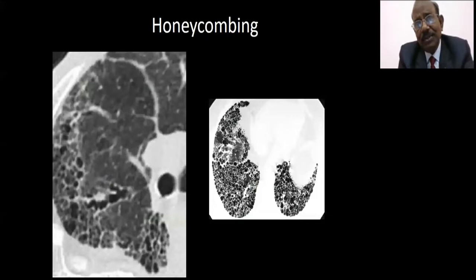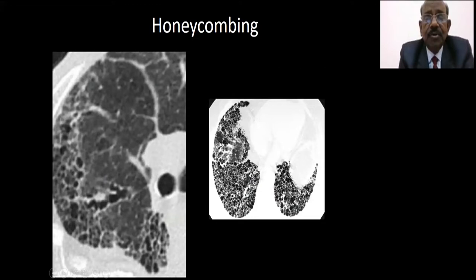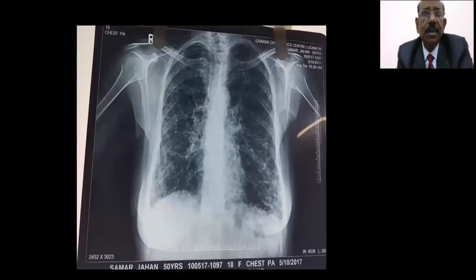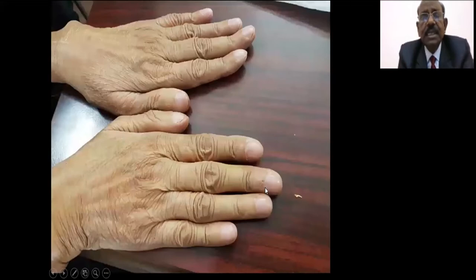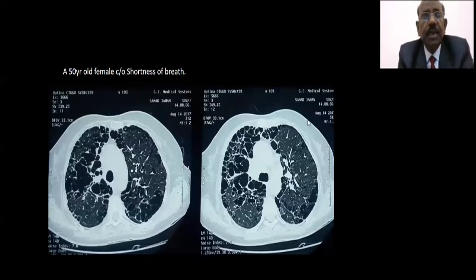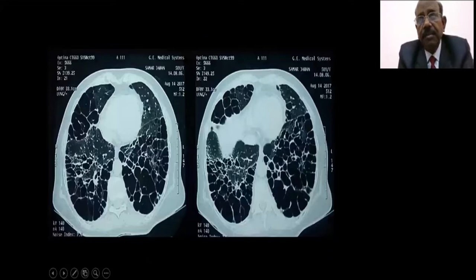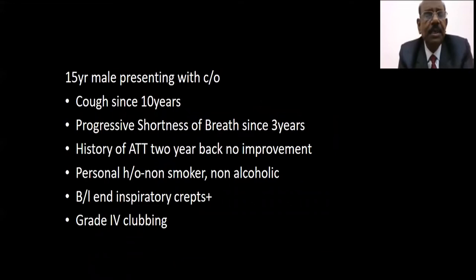A few more cases should not be confused with bronchiectasis. Here you see cystic-looking changes, but there is honeycombing and traction bronchiectasis — this is another term, but you do not treat this like bronchiectasis. This condition is idiopathic pulmonary fibrosis. Even in IPF you may get bronchiectatic changes. In other ILD types you may also find cystic spaces, but this patient had clubbing. There were a lot of cystic spaces visible. This is a cystic type of ILD and this case was diagnosed as lymphangioleiomyomatosis — LAM. These are not actually cases of bronchiectasis but they mimic bronchiectasis.